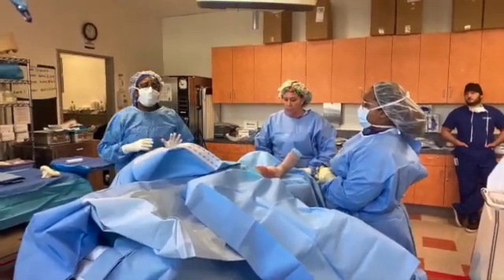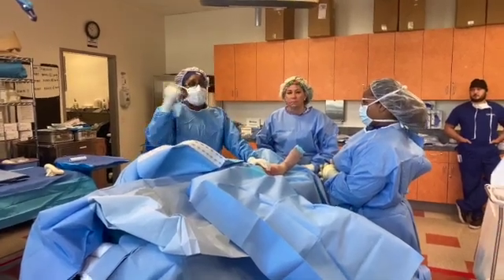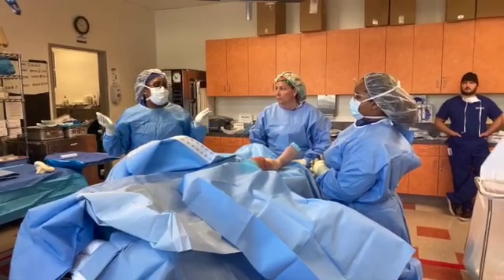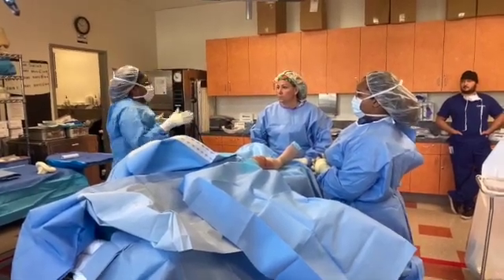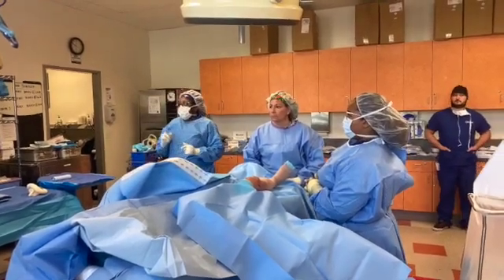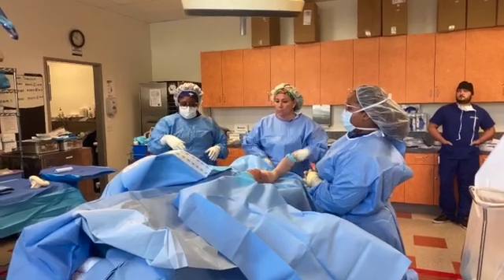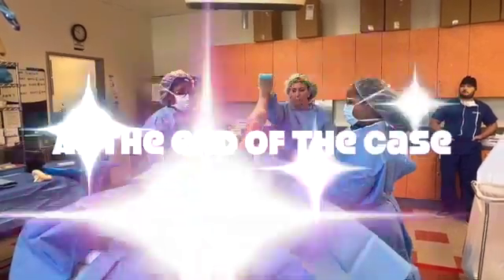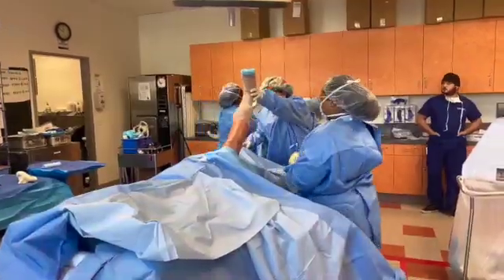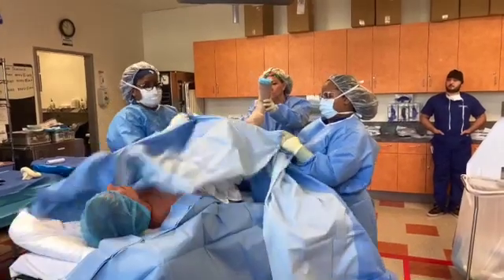You want to know how we get over that? Tourniquet down. Last sponges, we wrap. Leg up. Tourniquet down for 5 minutes. Tourniquet back up. It's not ideal, but in those instances when we still have more work to do, that's what happens. Real world application. All right? After removal of drapes, remove flexible latex bandages around tourniquet. Document tourniquet time. Document tourniquet inflation and deflation times. And then reassess skin site.